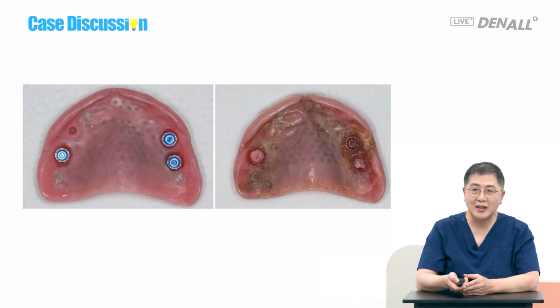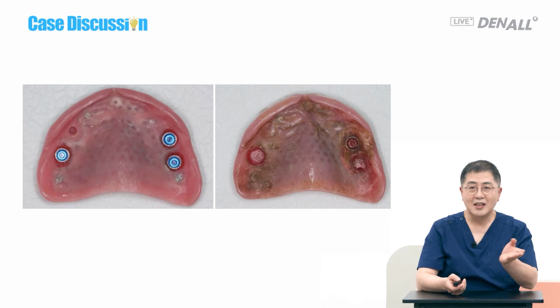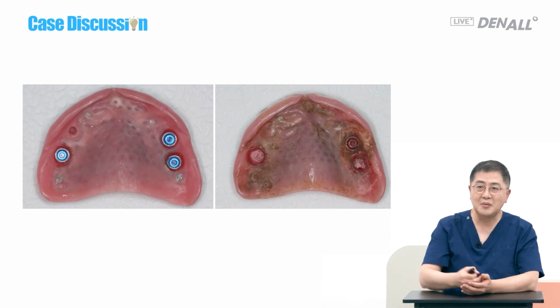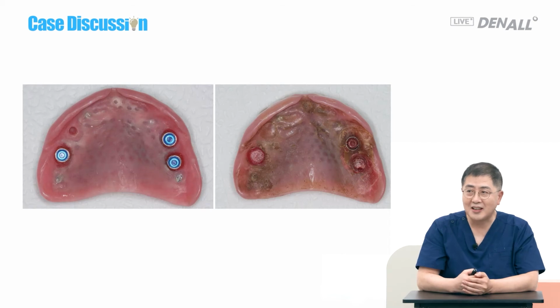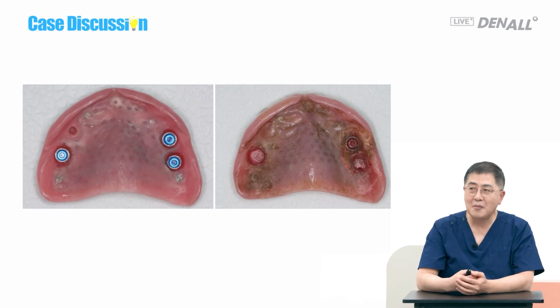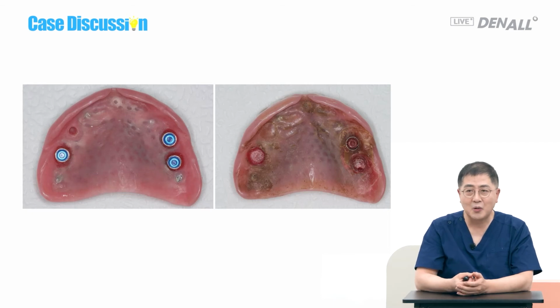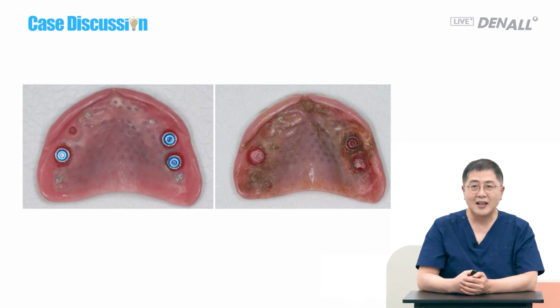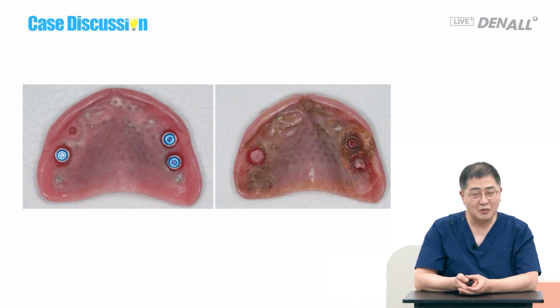The result is like this. The locator attachments are worn out. On the right-hand side, the young denture became very old. So many complications, and the patient comes back to me frequently, and I want to seek alternative treatment, but the patient got used to this and she doesn't want anything else.